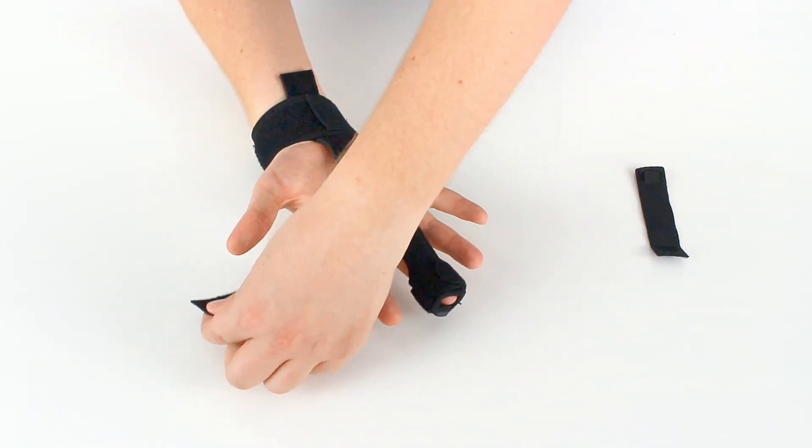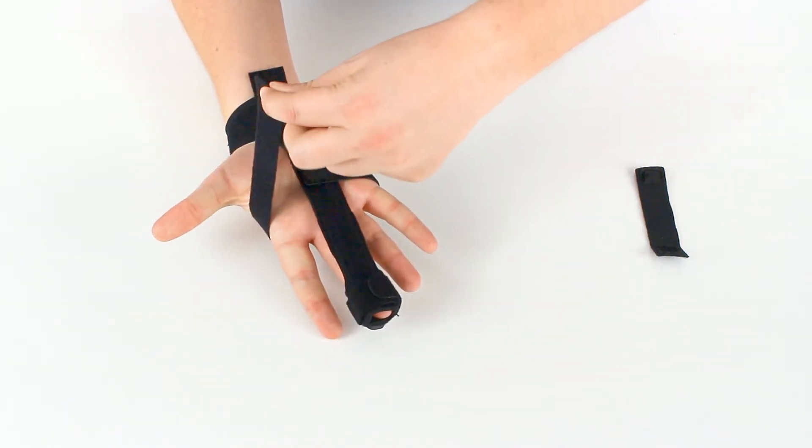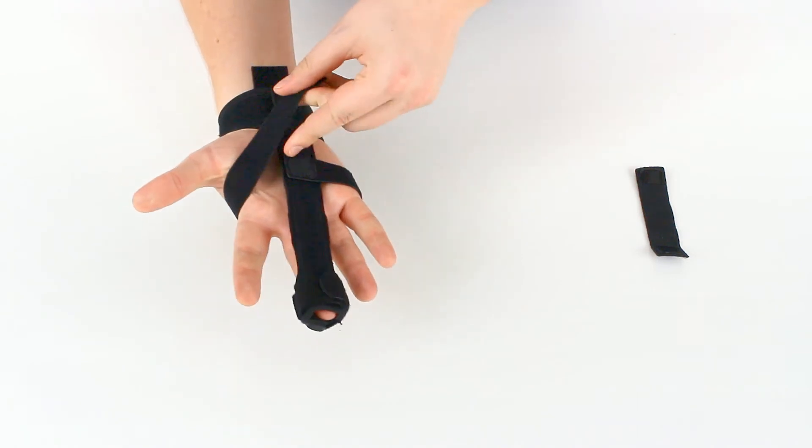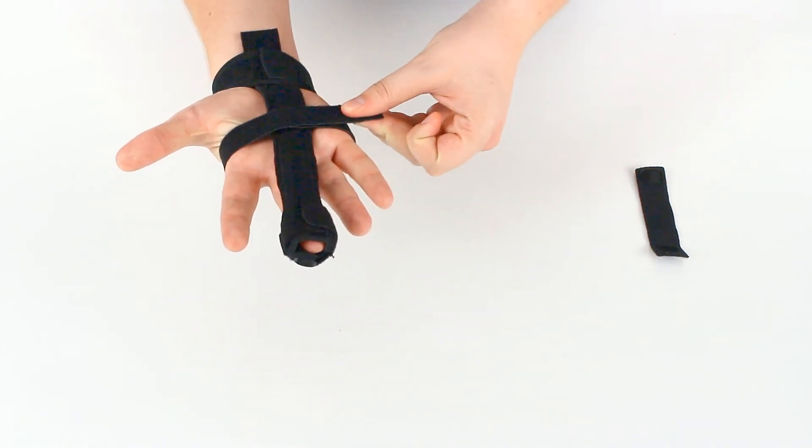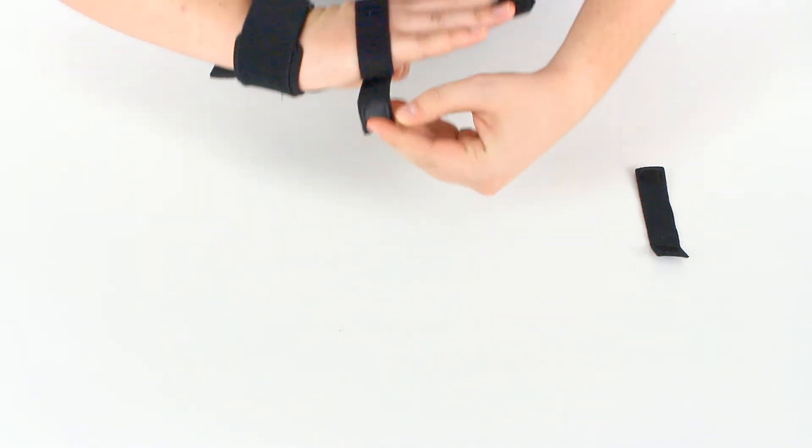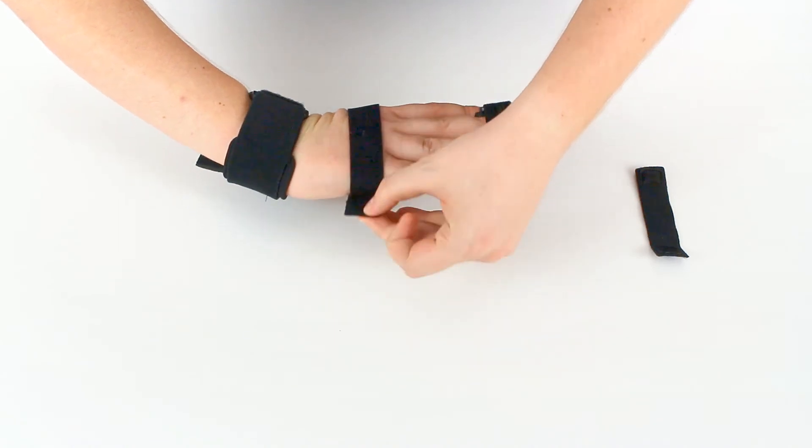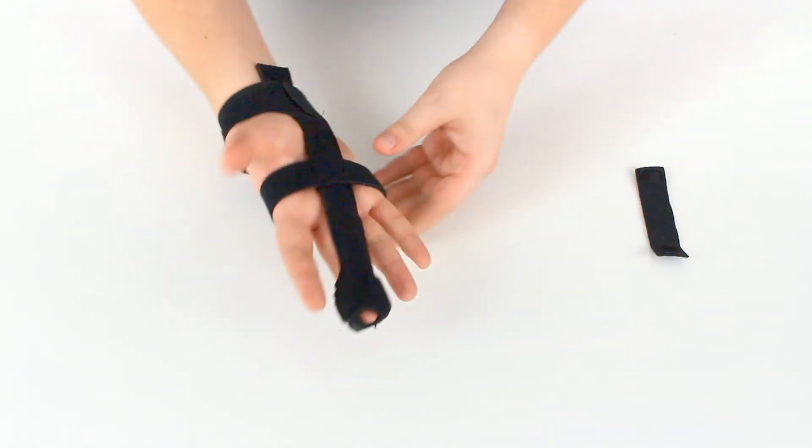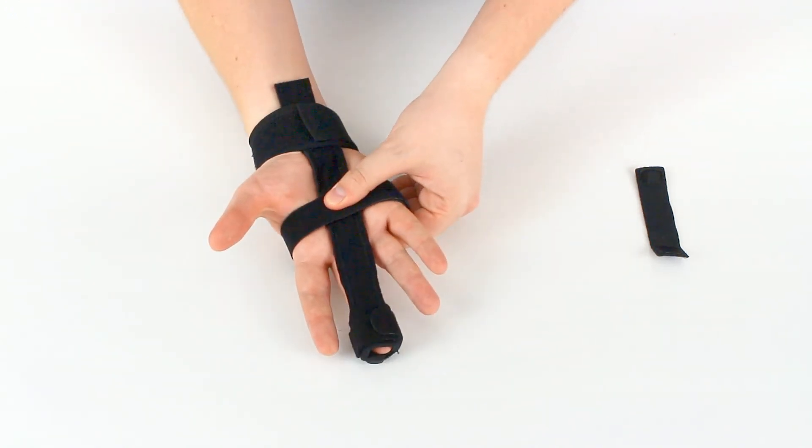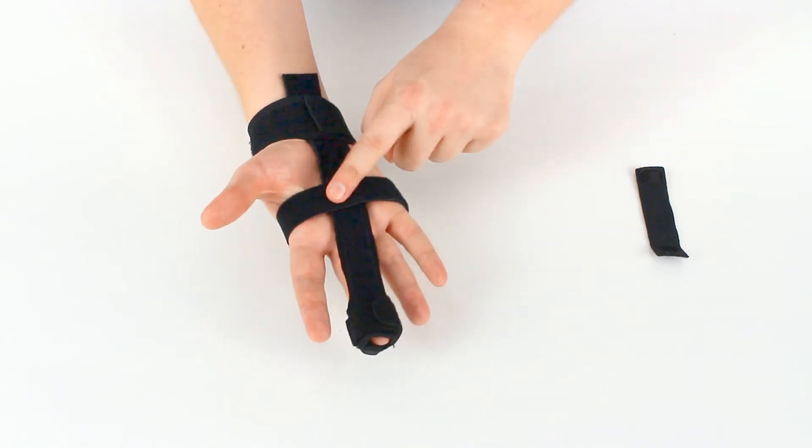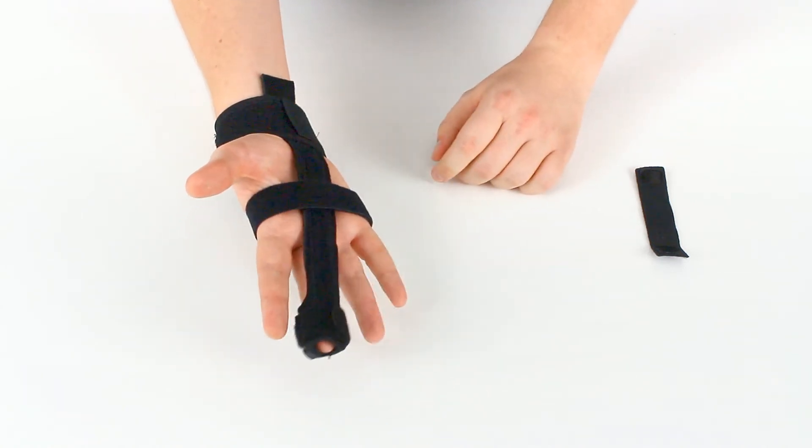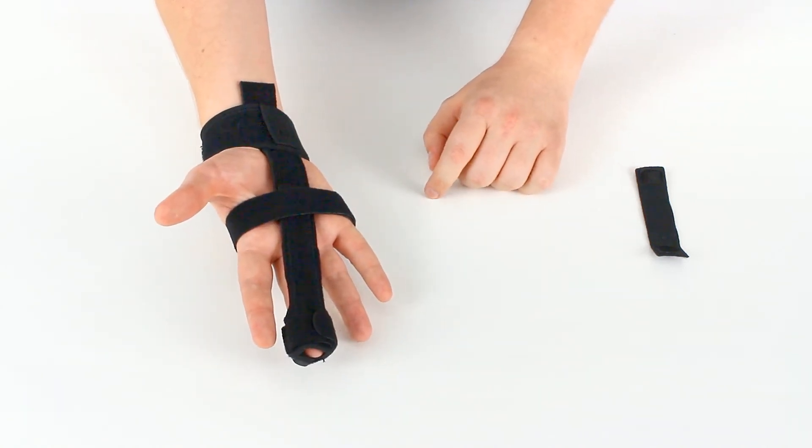We can now take this end, wrap it around so that that patch is holding the strap and the velcro here is also gripping. So we have two points of grip around the palm to get even more stability.